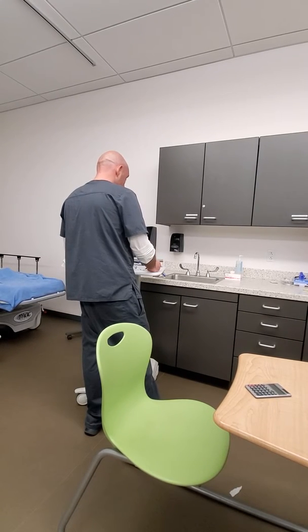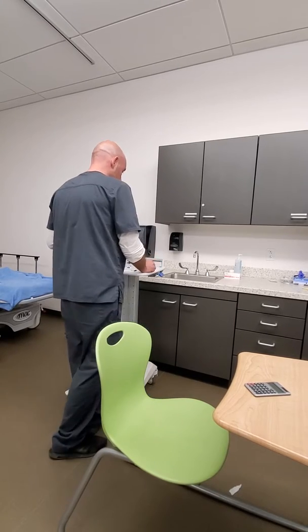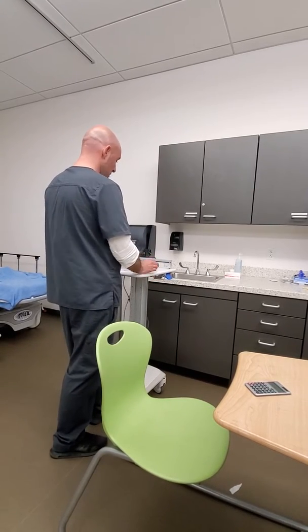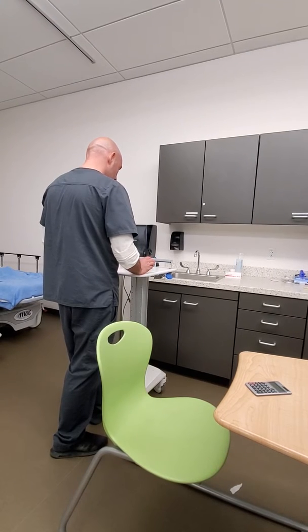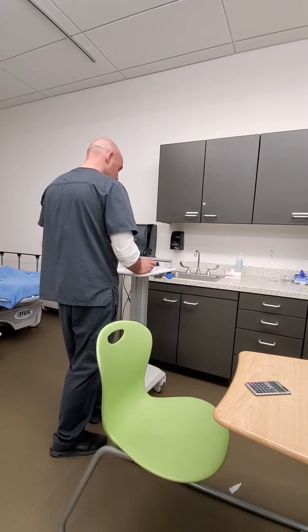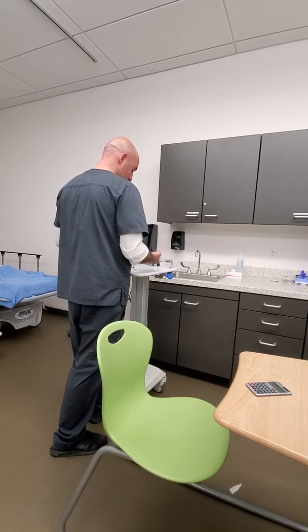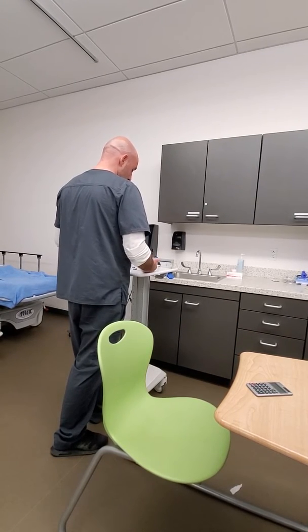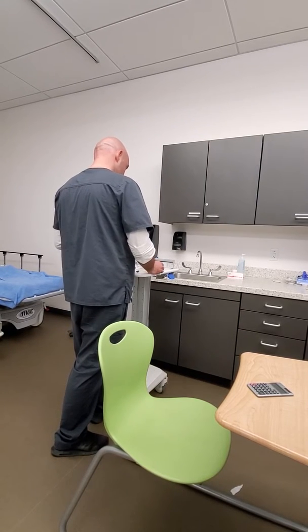And I have checked that Ancef and normal saline, which is already infusing, are compatible, so this is okay to use. And then it's for Jane Tripp, the right patient, the right medication. I'm supposed to be infusing this now.